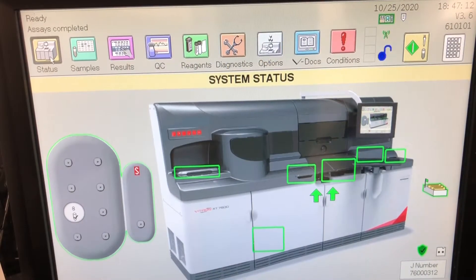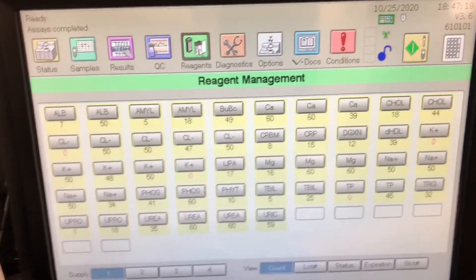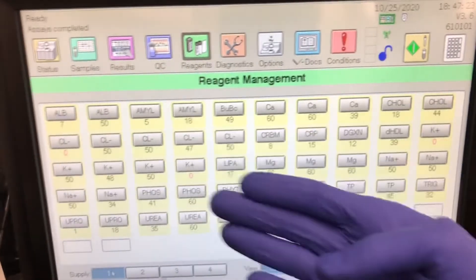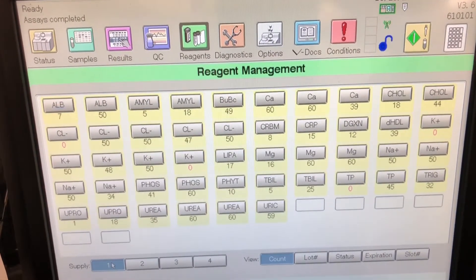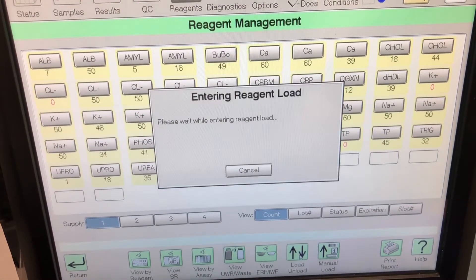Going to run through loading some of the reagents. Where you'll find them is you click on the reagent tab, and you will select the reagent section you want to go to: Supply 1, 2, 3, or 4. Supply 1 and 2 are for microslides, Supply 3 is for micro-tip, and Supply 4 is for micro-well technology.